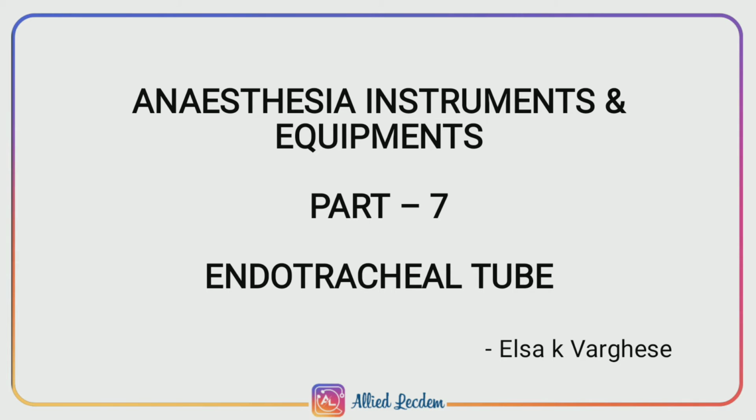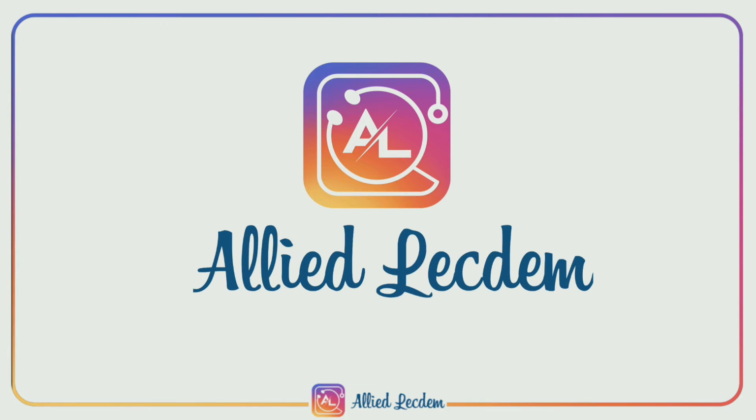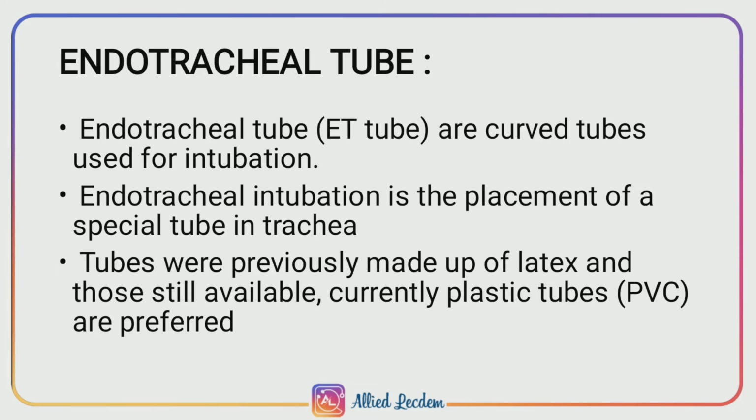Today's topic is about the endotracheal tube. This is a picture of a person who has been intubated with an endotracheal tube. Endotracheal intubation is the placement of a tube in the trachea to facilitate ventilation. ET tubes are curved tubes. They have two ends: the proximal end, which is the machine end, and the distal end, which is the patient's end.